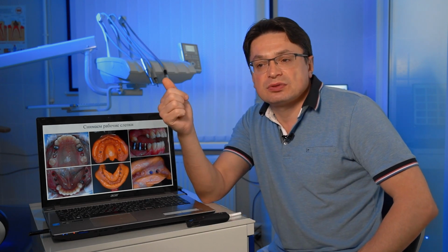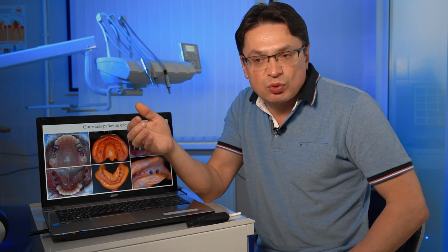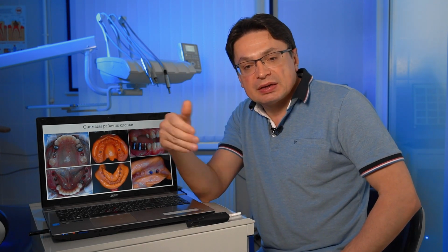It is not only a patient with whom you constantly communicate and who can offer you something of his own. And here you also need to speak the same language. You need to talk with evaluative characteristics. Here it is bad, here it is good. You must tell where to correct. That is, you must be able to control the work using the articulator.